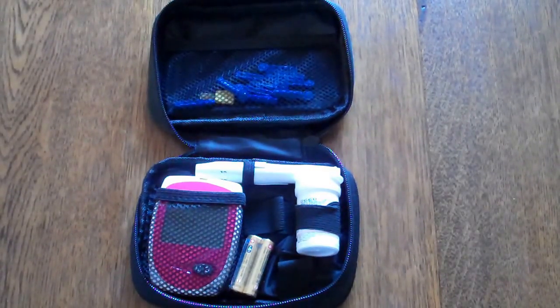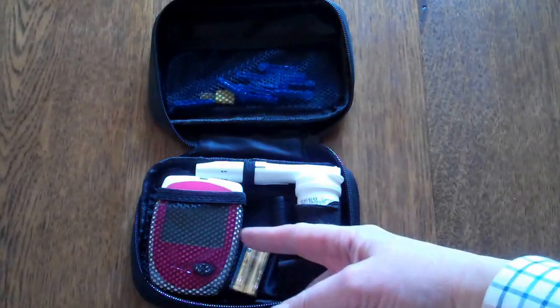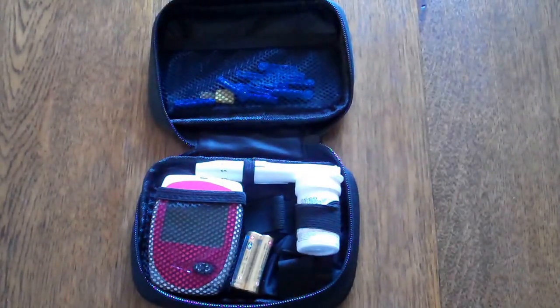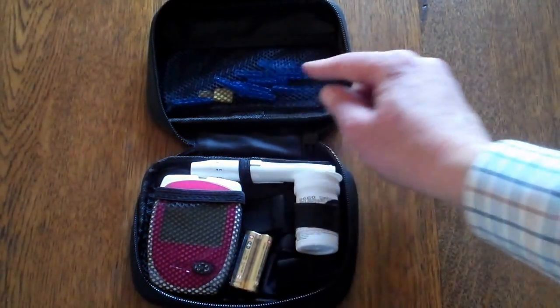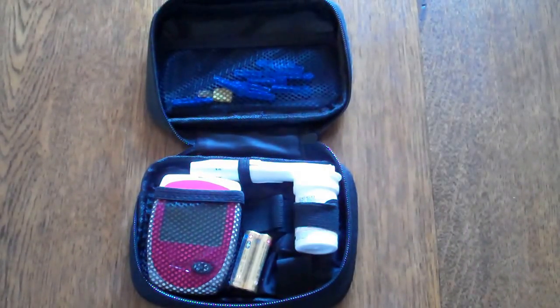The meter pack when you order it comes boxed with instructions. The actual contents include the digital meter with batteries, five test strips with a code chip, an auto lancing device, and a supply of lancets. The lancets fit into the auto lancing device and automate the finger pricking to enable a capillary blood sample to be placed onto a test strip.